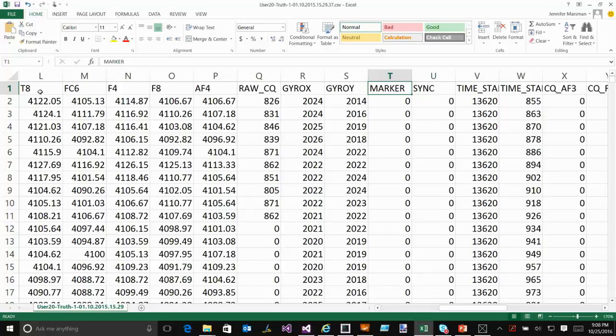Here's the marker column. So this comes through as all zeros, and then I was putting them as ones, like when we started the conversation, and then I was doing a 1 and 2, so then I could parse out everything between 1 and 2, for example. So the markers allow me to do that. And then the timestamp, the way they do timestamp is they have the timestamp in seconds and in milliseconds in 2 separate columns. So I threw an additional column on the end where I do seconds times 1,000 plus milliseconds to get it all in one value to make math easier. So that's how they do it right there, but I'm overwriting that later.